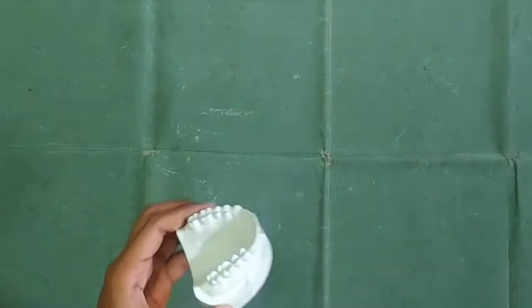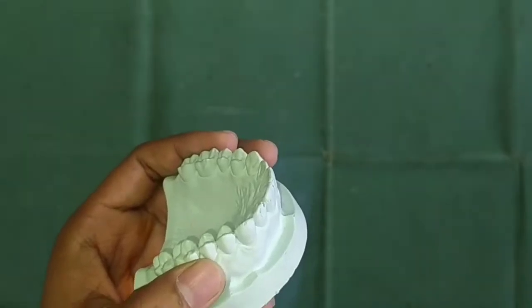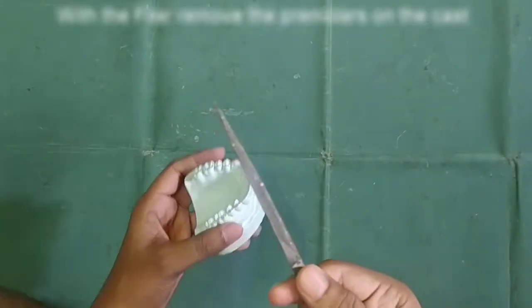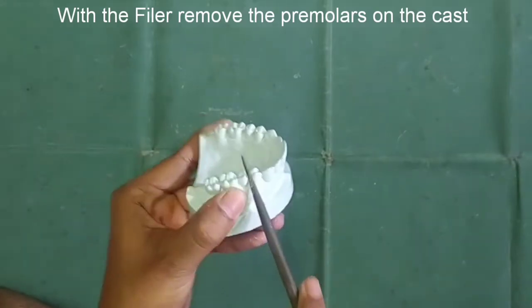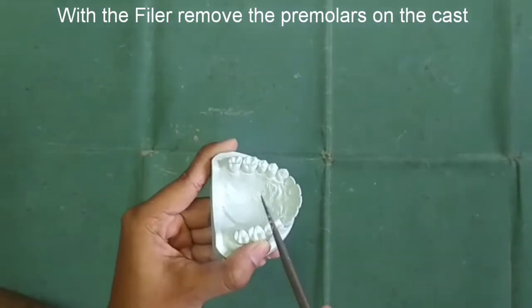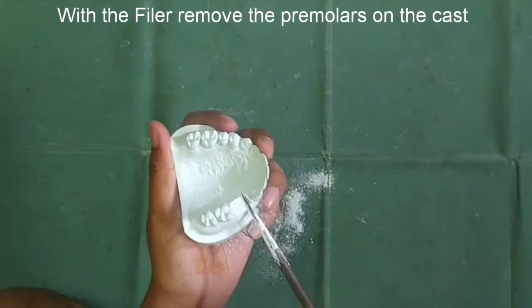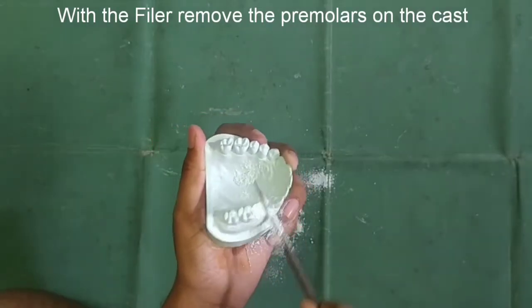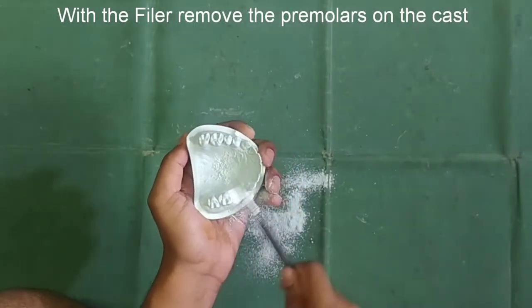I am using this ideal cast and I am going to fix the premolars. I will file the premolars on the cast with the filer, filing a bit below the cervical line, such that our acrylic tooth will completely fit into it.